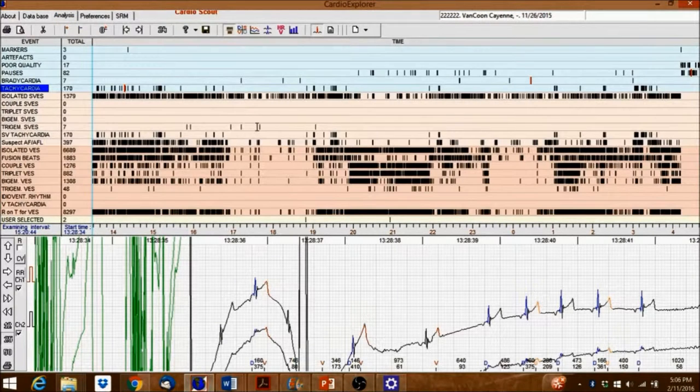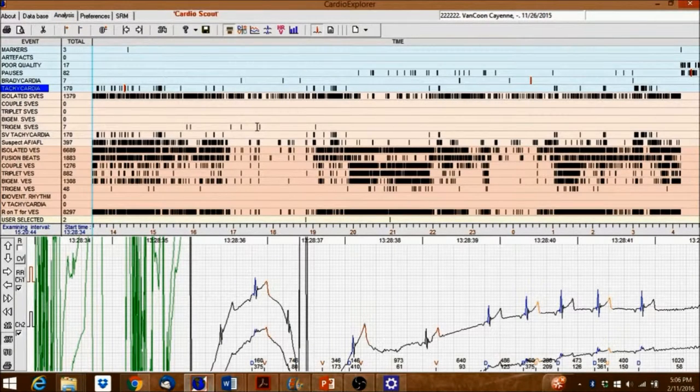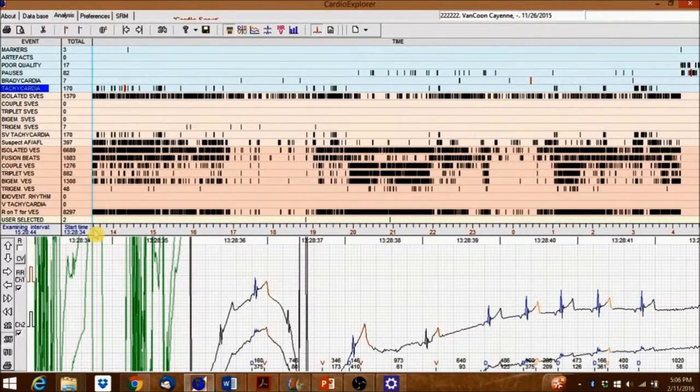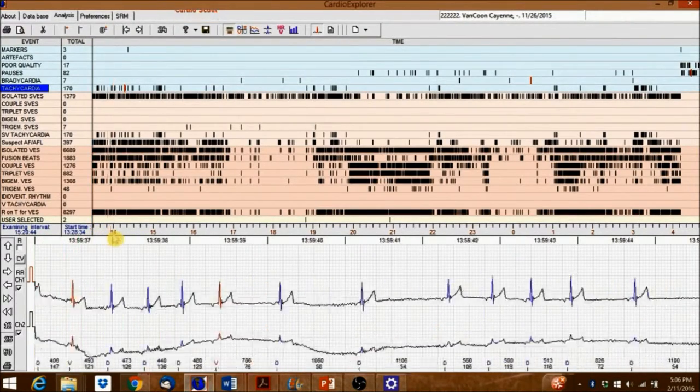Left-click inside the horizontal scroll bar to manually move through the recording.